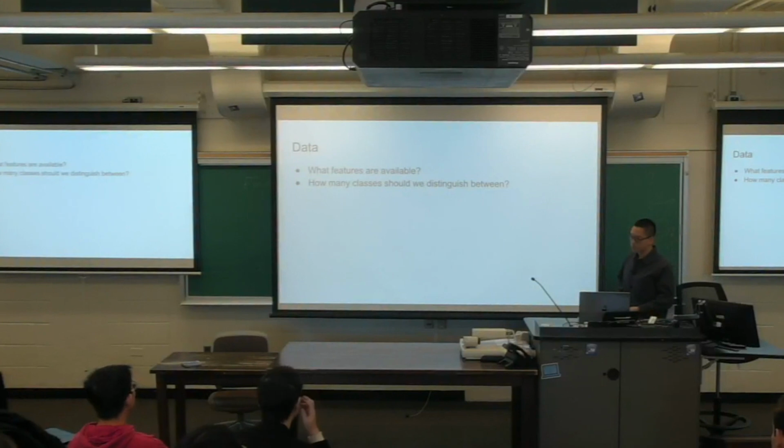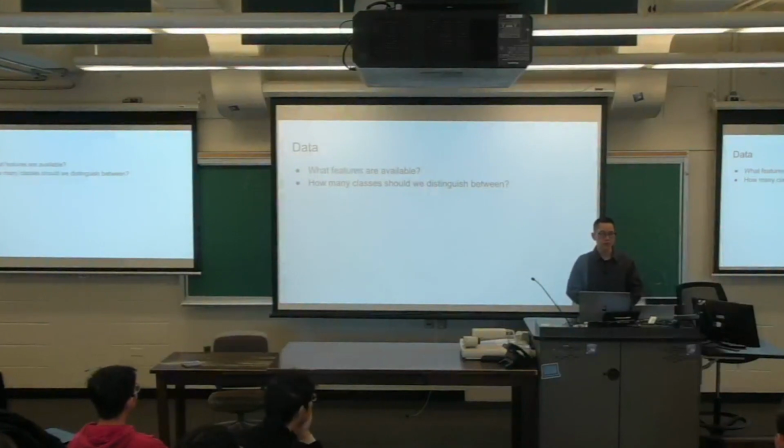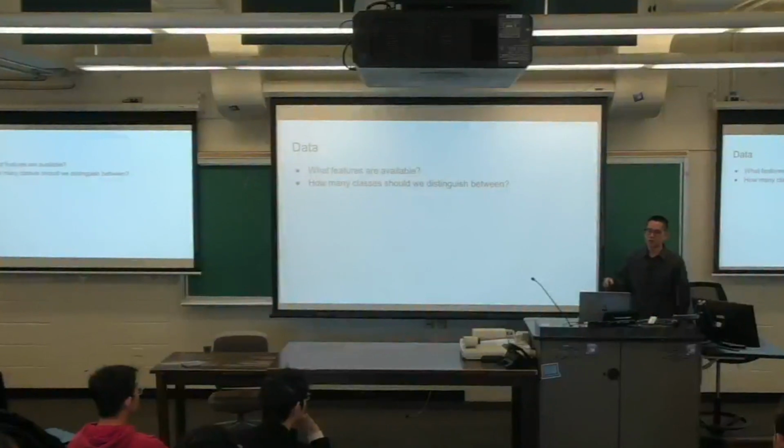And then how many classes should we distinguish between? And this is an easy one, because for our case right now, we are distinguishing between open and closed. So we are solving a 2-class classification problem.